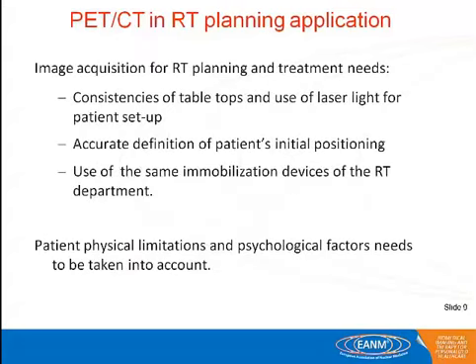Image acquisition for RT planning and treatment has its needs. We need consistency of tabletops and the use of laser lights for patient setup. We have to be in the same situation as in the treatment, with a definition of the patient's initial position, so we know how the patient will be positioned for radiotherapy. We do the PET-CT in the same position, and we have to use the same immobilization devices of the radiotherapy department. They bring us their immobilization devices, and we use them with our PET scanner.